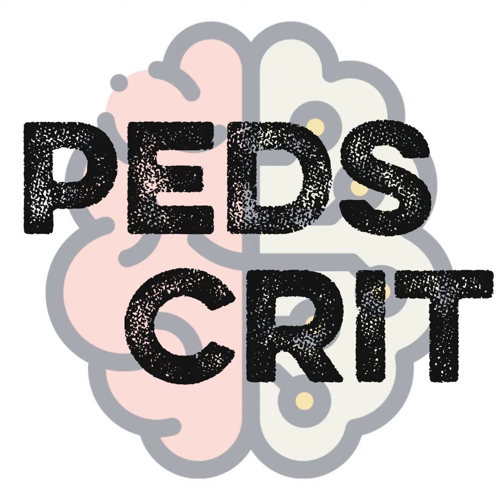Like if I gave you an arterial line with an obvious whip and a non-invasive blood pressure that didn't correlate, we would all understand that there's a mistrust of some of the numbers being reported. You maybe don't need to start this patient on a blood pressure medication because you don't actually trust this. There's nothing fundamentally wrong with the line, but there's an artifact that's been introduced into what this number is measuring, right?